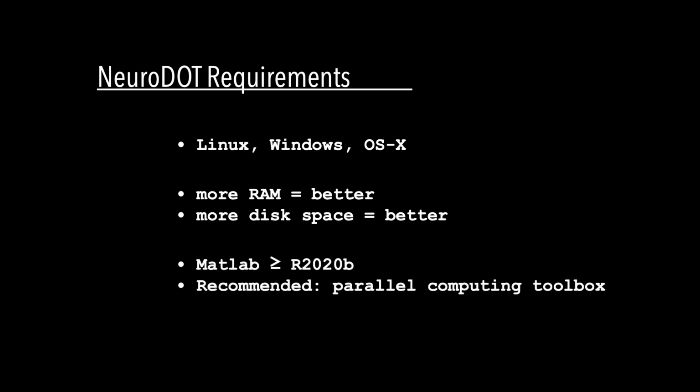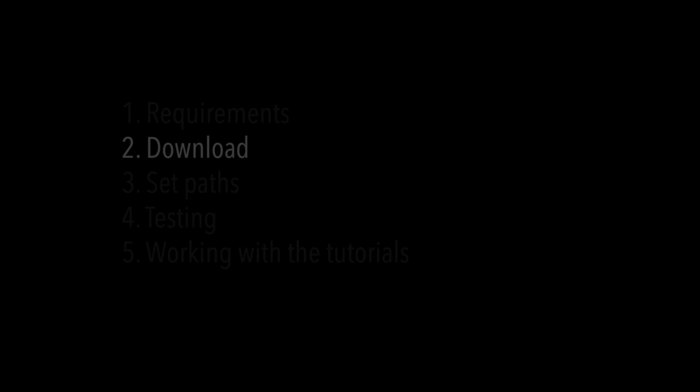The only formal requirement is that you are running a recommended version of MATLAB. The code has been optimized for MATLAB 2020B and may run poorly or not at all using an earlier version. No specialized MATLAB toolboxes are required. However, the parallel computing toolbox will be used for computationally intensive operations if it is available. This can substantially reduce the time required for processing. See the MATLAB documentation for help on installing and setting up the PCT.